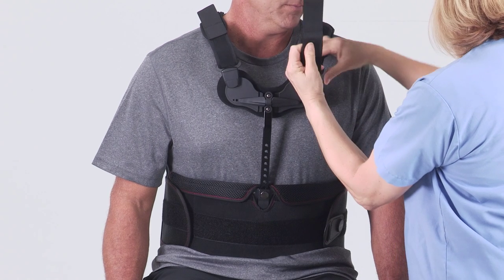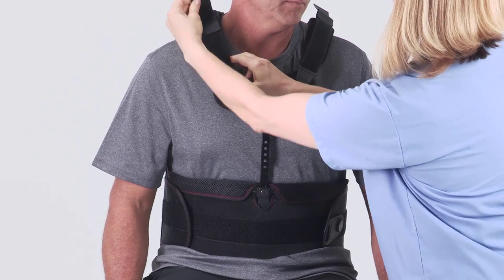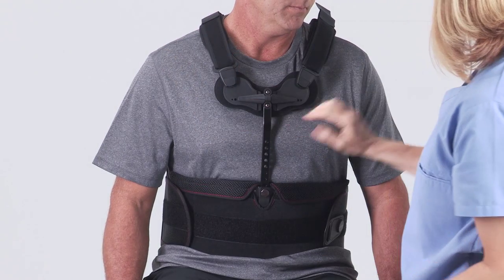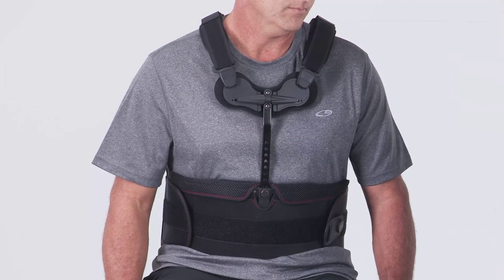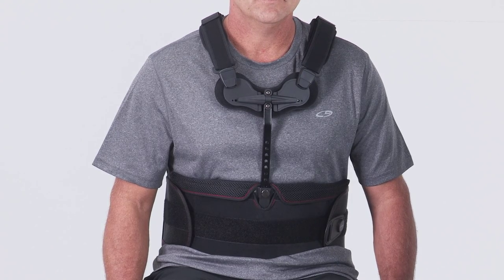Adjust the shoulder straps. Start by releasing and adjusting the back Velcro straps first, and then adjust the front Velcro straps. Be sure to maintain the bottom edge of the front panel with the pubic bone and the back panel between shoulder blades and lower back.